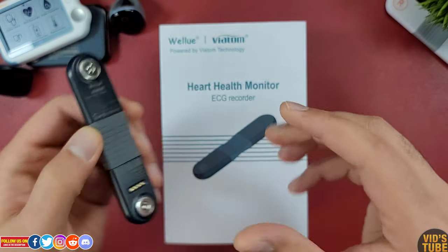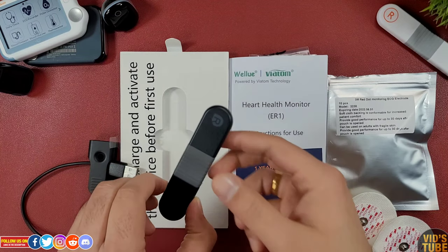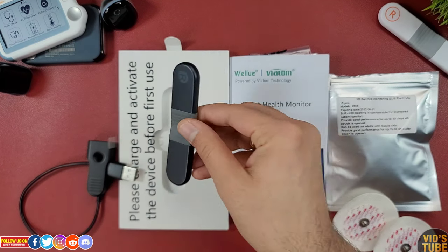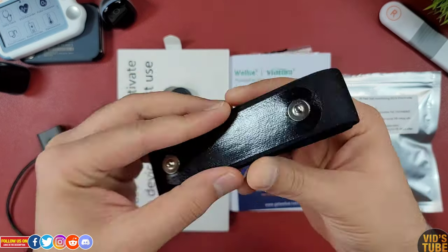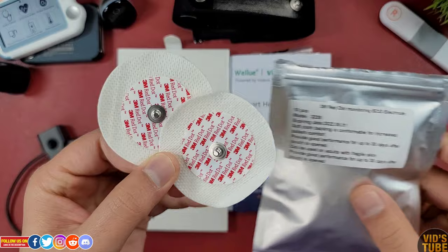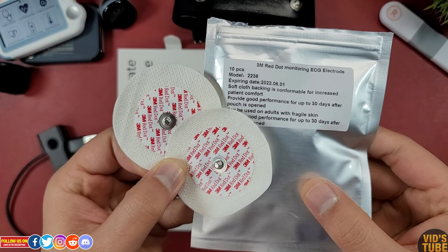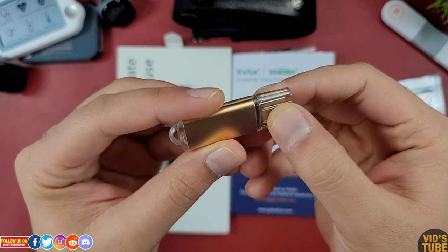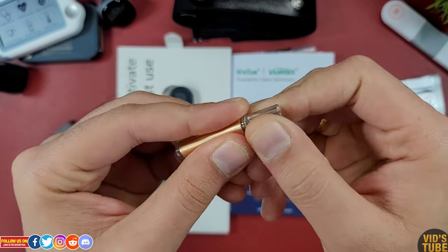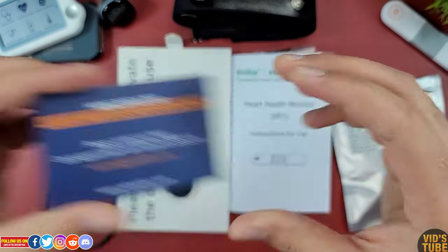It came in a box like this one. Inside the box you will find the AI ECG recorder itself, charger, chest strap, 10-piece 3M red dot ECG electrodes, a USB drive that contains the app to be used on PC or Mac to download the readings, a warranty card, and a user manual.